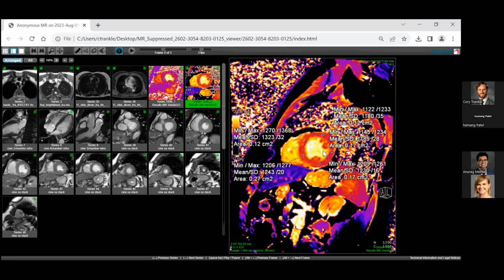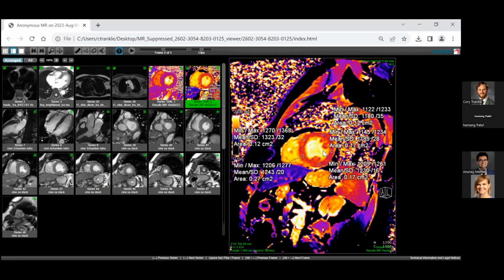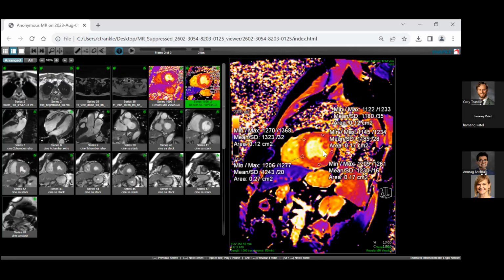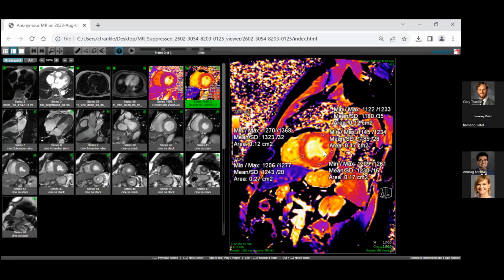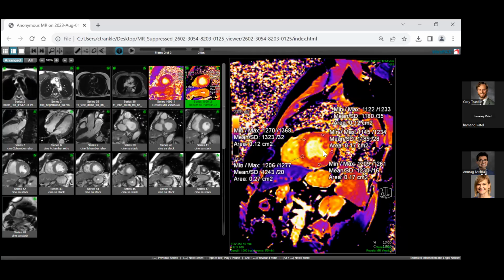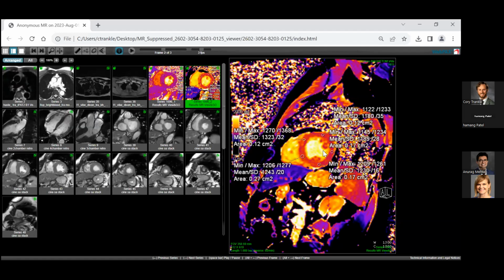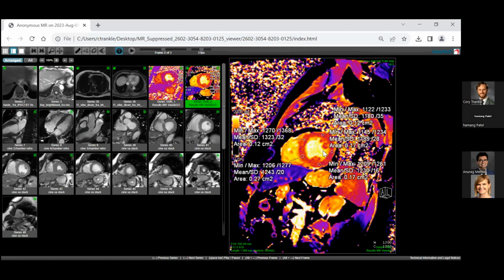Now, fat is a little tricky because we haven't talked about this, but the protons that are bound to carbon in fat have a little bit different spin characteristics than the ones that are bound to oxygen in water. So if there's fat in there, actually those T1 values can go down. But what else can make it go up? Infiltrated... yes, like what?